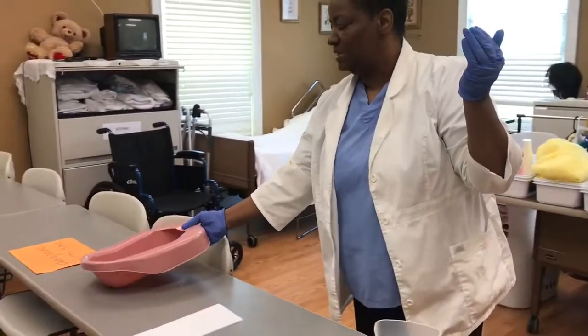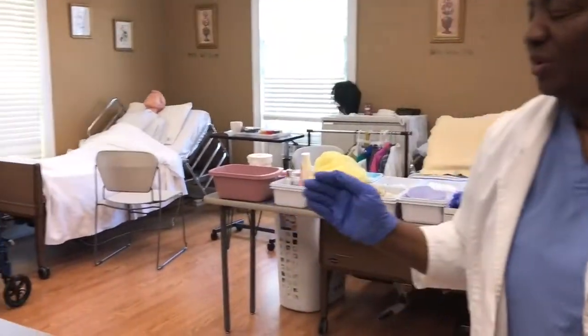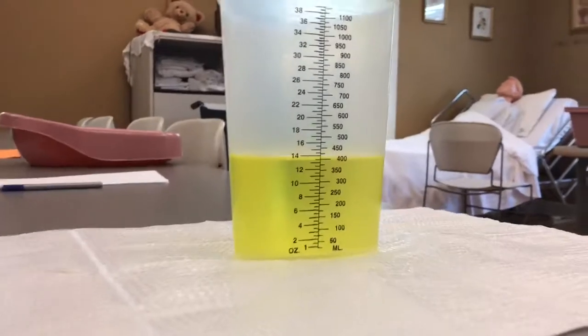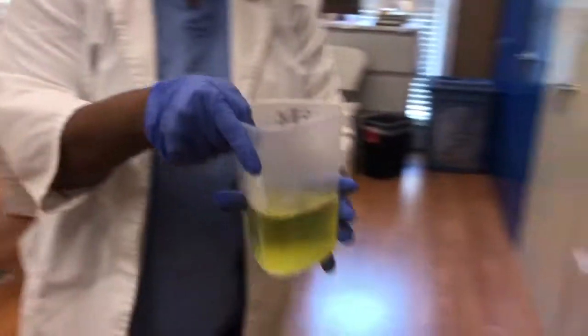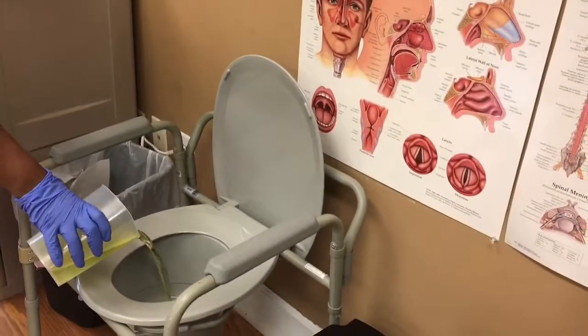For those people who may forget, or myself, I'm going to check one more time — 400 ml. Then I'm going to take the container of urine and pour it into the commode.